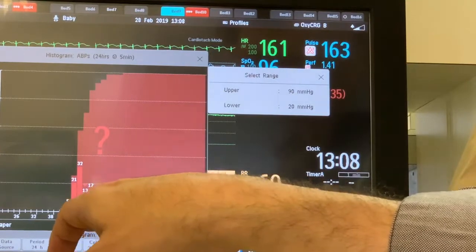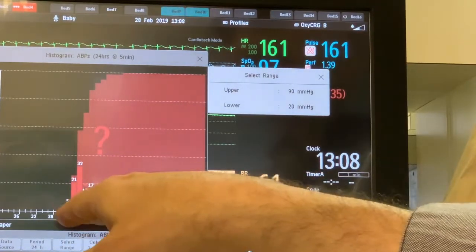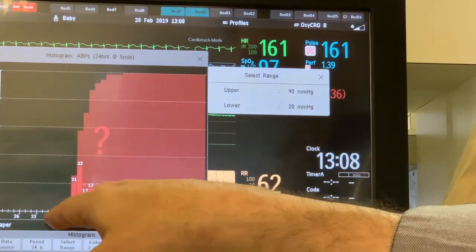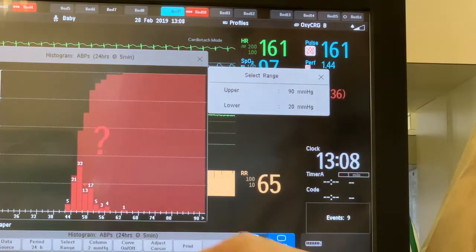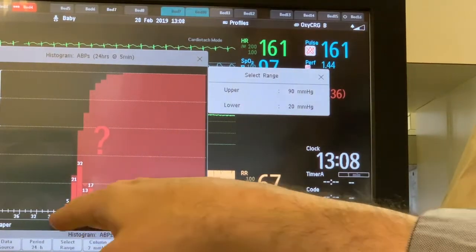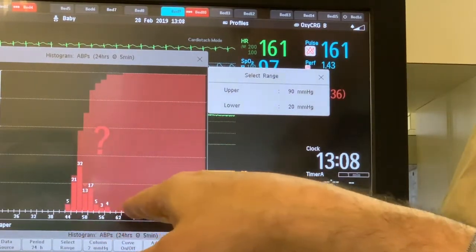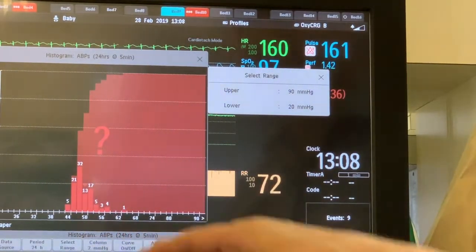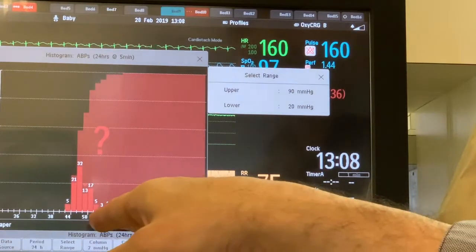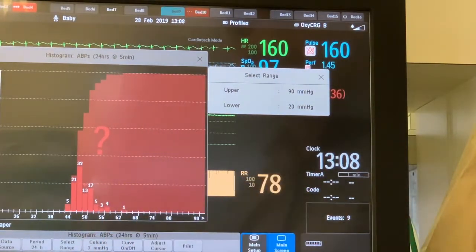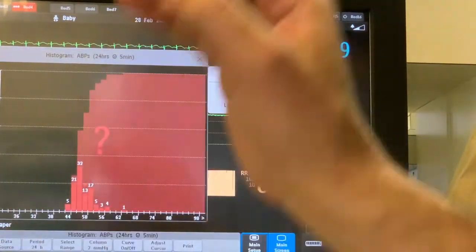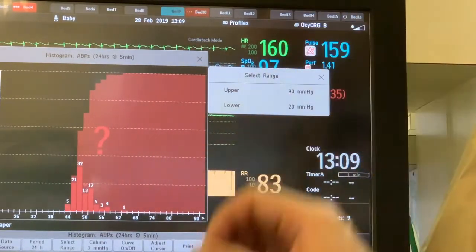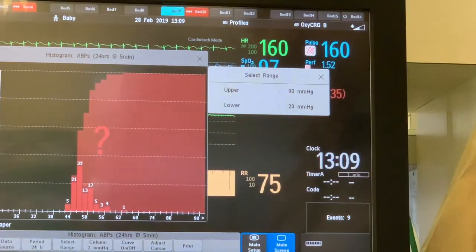For this infant over the last 24 hours, systolic blood pressure was always higher than 40 mmHg. The upper limit was reasonable — 60 mmHg or less. So that's perfect: a normal, acceptable systolic blood pressure histogram for the last 24 hours.